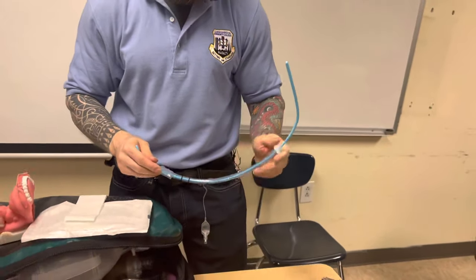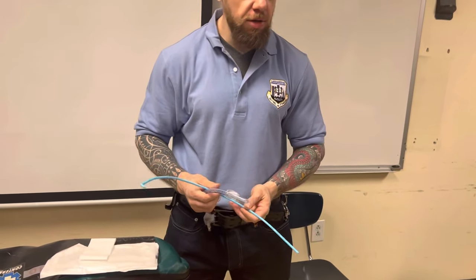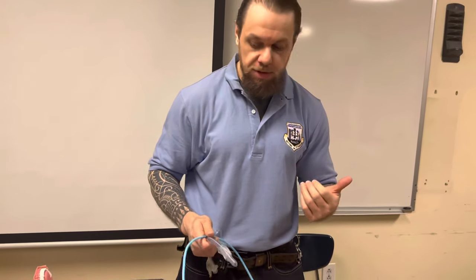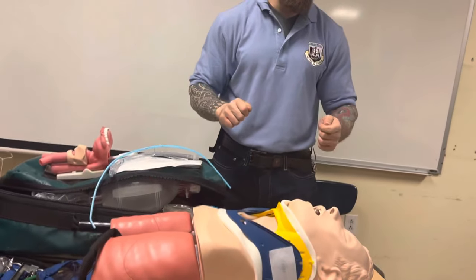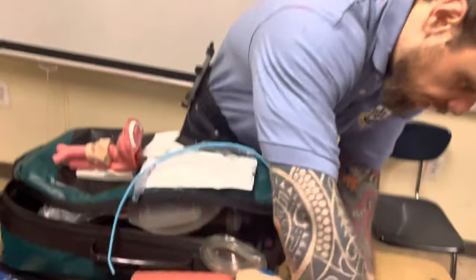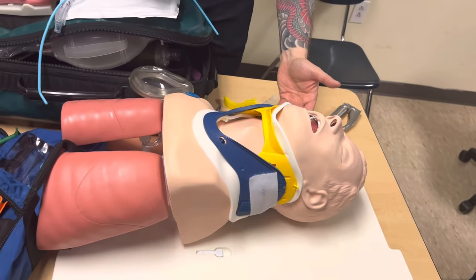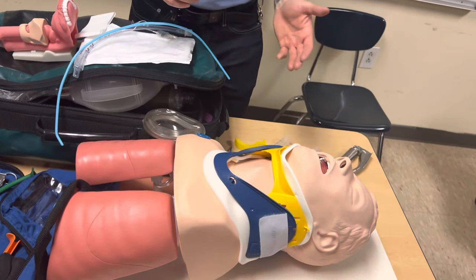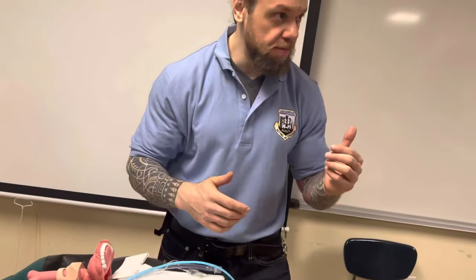How we're going to do this procedure: we're going to have one person who is my partner and they're going to perform what's called the earmuff technique. Once we open the collar - and we need to open it so the jaw and the mandible become mobile - the partner is going to grab the ears. Their job is essentially not to allow the head to lift off the stretcher. Your job is to hold the ears so the head does not move up.